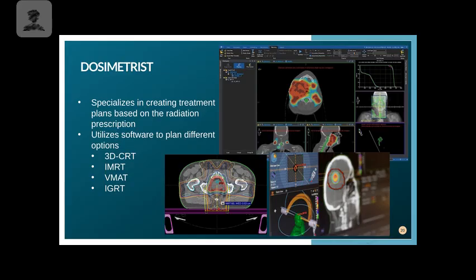And then a prostate patient over here, you can see there's going to be multiple beams. They're going to have a beam that comes from this direction, this direction, this direction, and then a couple coming from the front. So 5 different beams there, and they're all going to be delivering dose to this area within here, which is going to be the prostate. All of the other drawings around there in different colors indicate how much radiation dose would be given within those structures based on those beams. So it's truly a process for them.